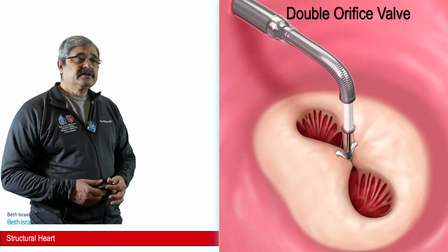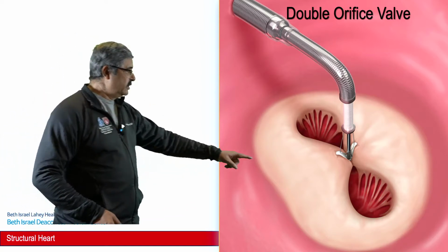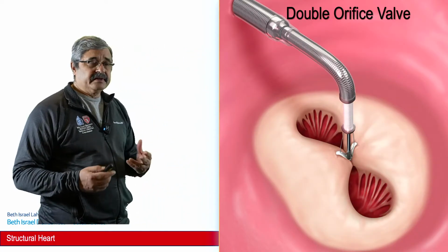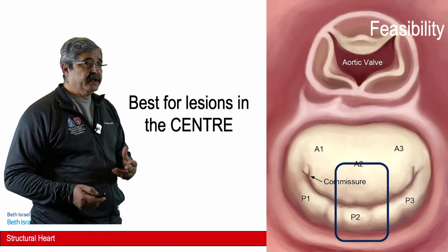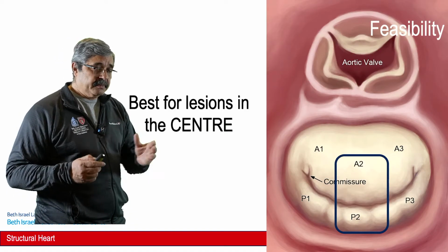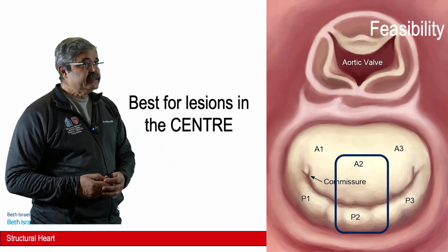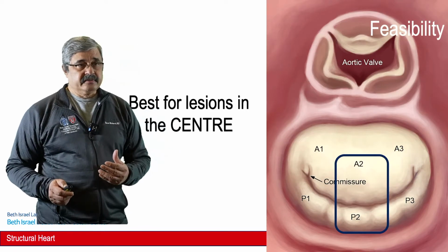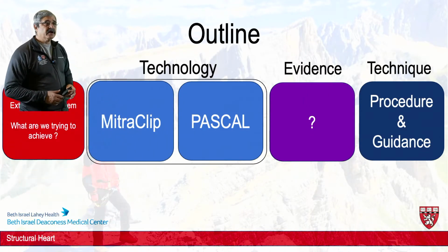And at the end of the day, when this happens, this valve gets converted into a double orifice valve. This is the anterior leaflet, which gets clipped to the posterior leaflet, and that's what makes it a double orifice valve, and that's called an edge-to-edge repair. Most of the time, this is best for lesions in the center of the valve, that is called the A2 and P2 region of the valve, which is the most easily acquirable target, and therefore lesions in the middle of the valve are very easily treated with transcatheter approaches.